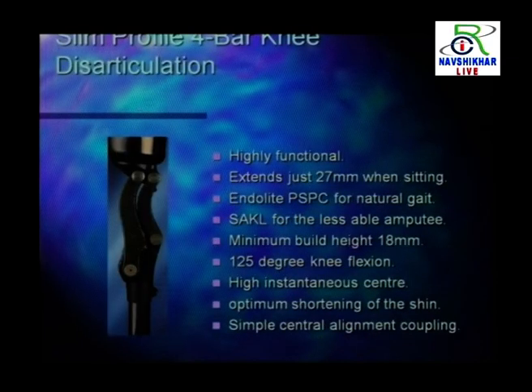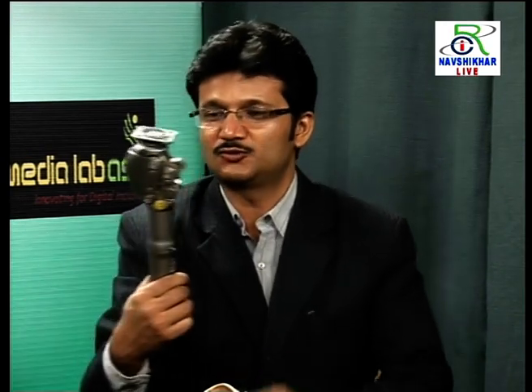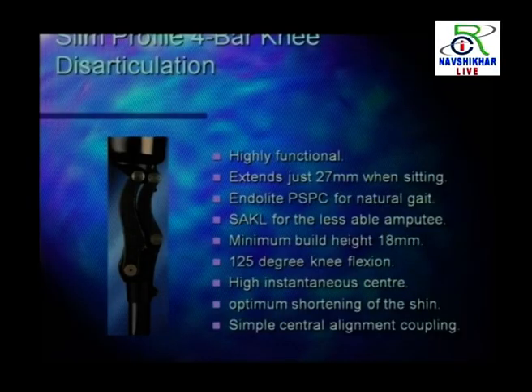We are going to discuss the four-bar knee disarticulation prosthesis. It is basically used for knee disarticulation patients, where the tibia and femur are separately disarticulated, and such a disarticulation is not actually an amputation. In such amputation, the basic problem is that if the patient is using an above knee prosthetic joint, when he is sitting, the prosthetic joint comes ahead of the normal limb. To alleviate such a problem, the four-bar knee disarticulation prosthesis was invented. While sitting, the posterior bar comes beneath the anterior bar, and the prosthetic knee joint doesn't come far forward from the normal limb.